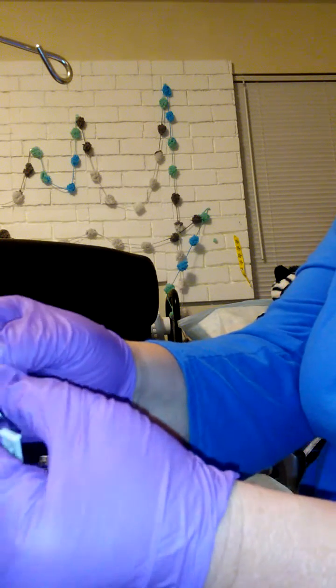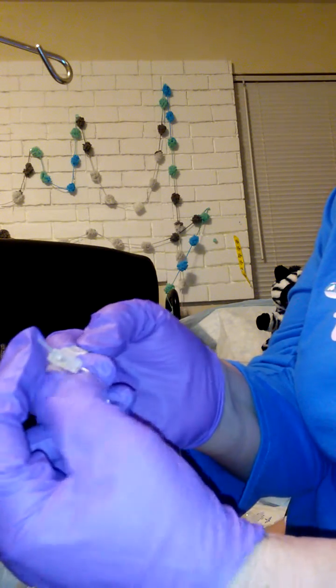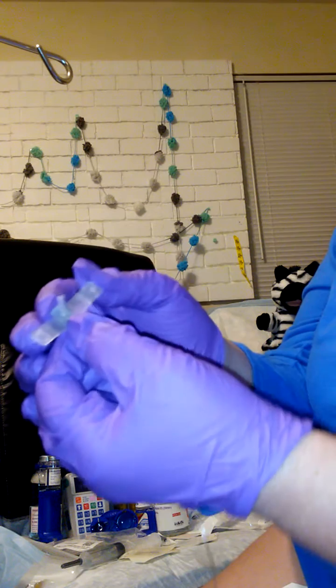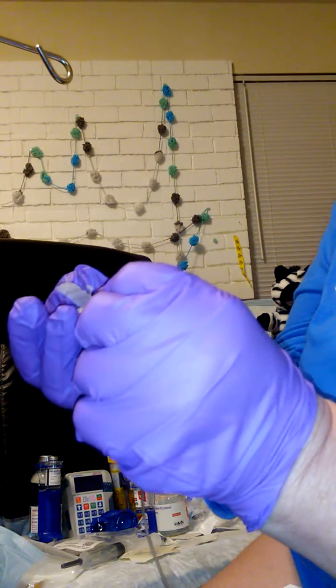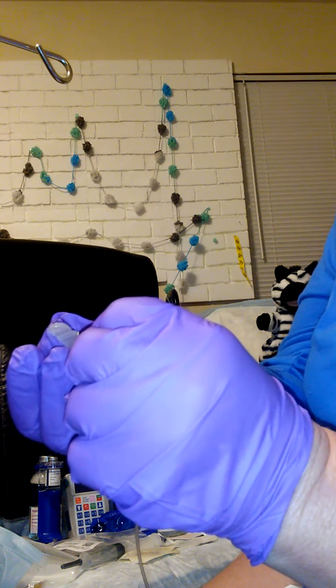There's a needle. They call this a butterfly. Looks like it's got the wings, but this is the needle. And they did not send me the small needles I requested. I've been struggling getting these needles into my skin because I've done this for so long. I'm sort of calloused, but this comes off, and there is the needle. It's not really big, but it's giving me some grief recently, trying to get it to go.